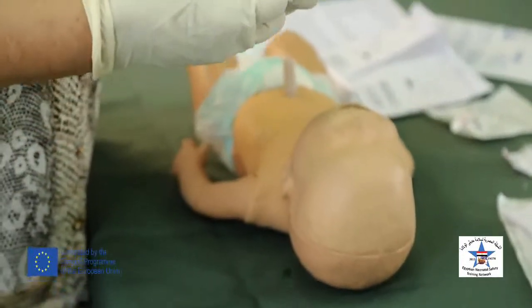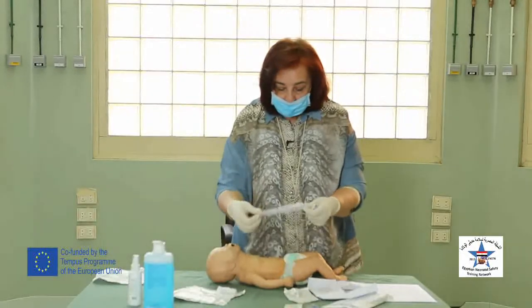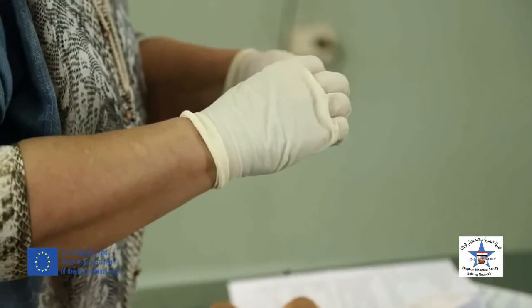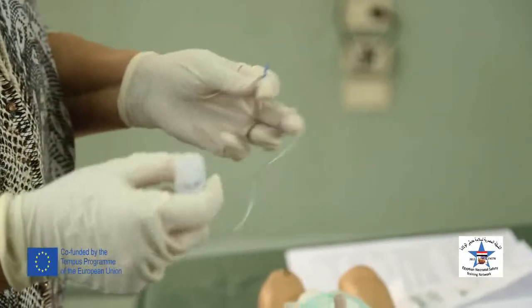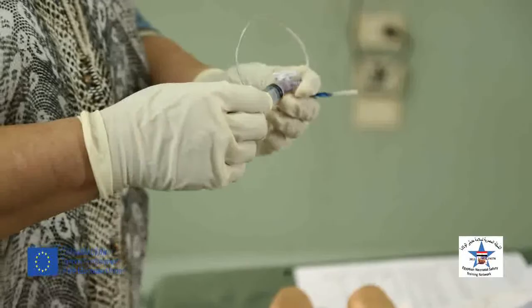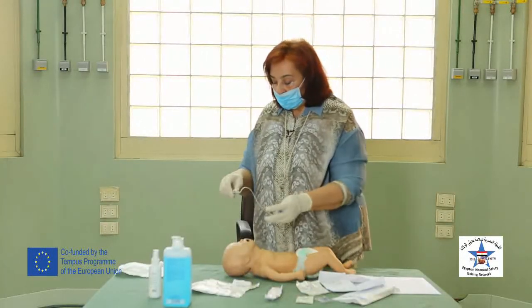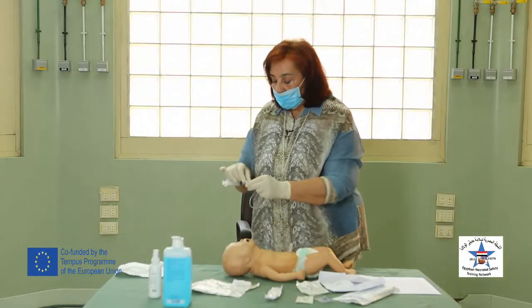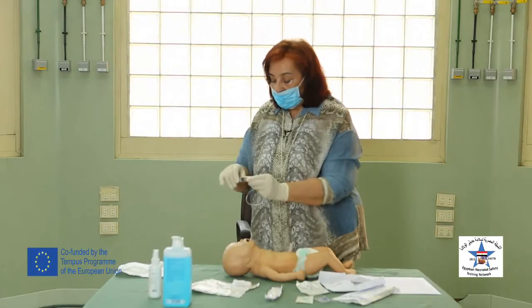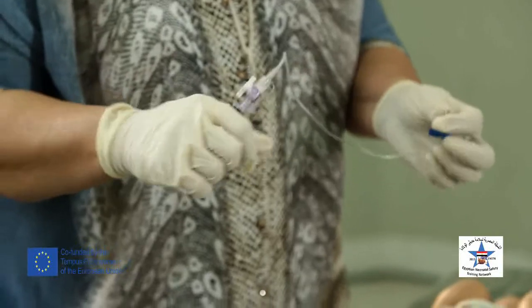I will connect the 3-way connector to the butterfly needle, and to the other port of the 3-way connection, I will attach the 10 ml syringe. Now my connection is ready. I will align my connection so that the syringe and the butterfly needle are on one line, and the opening to the outside atmosphere is closed.